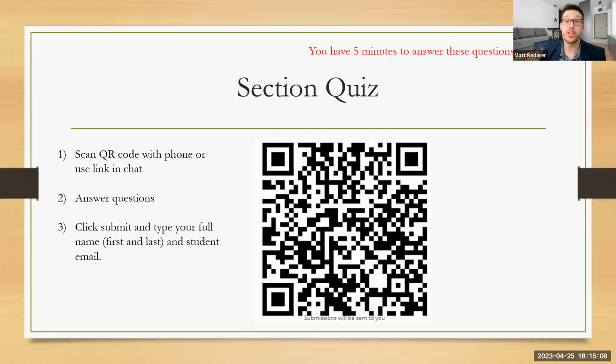It's hard to see the contrast there. So CT is not typically used for ruling out something like this. Not to say it can't be, but no physician typically wants to go subpar and make a complete call on that. Because it could risk the patient. Patients could be paralyzed if they make the wrong call.